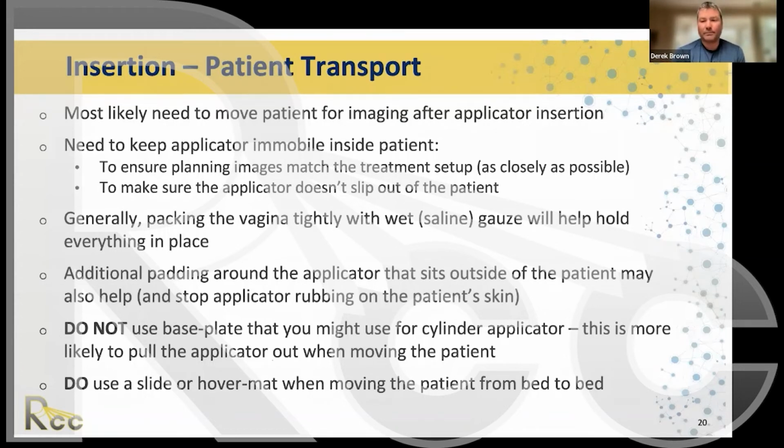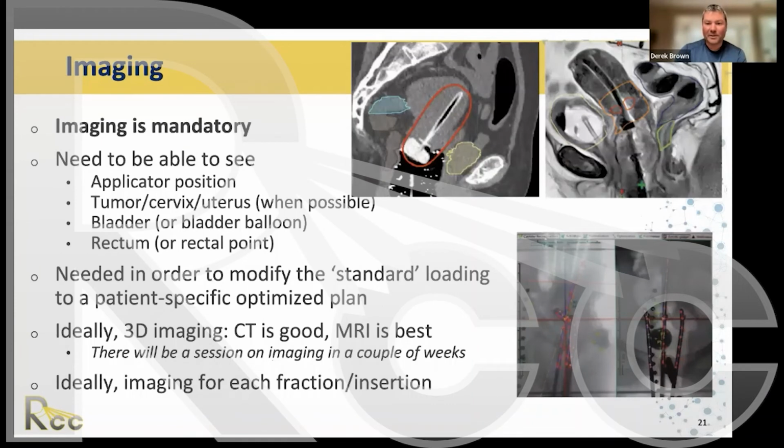Anything that you can think of. You need to get creative with your immobilization for Tandem and Ovoid. Imaging, some form of imaging is mandatory.